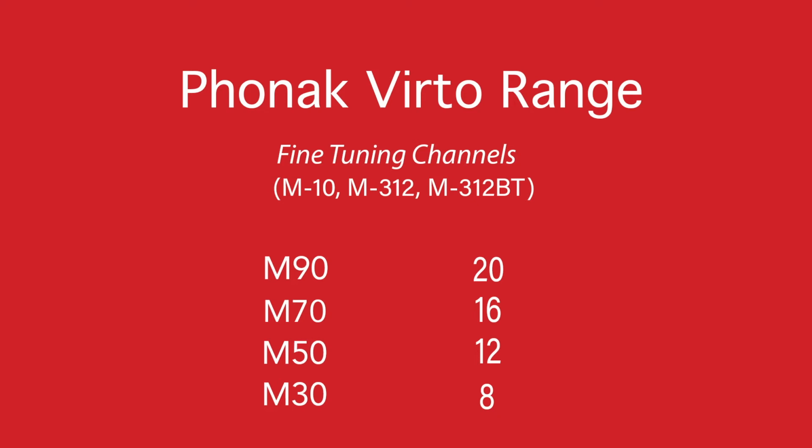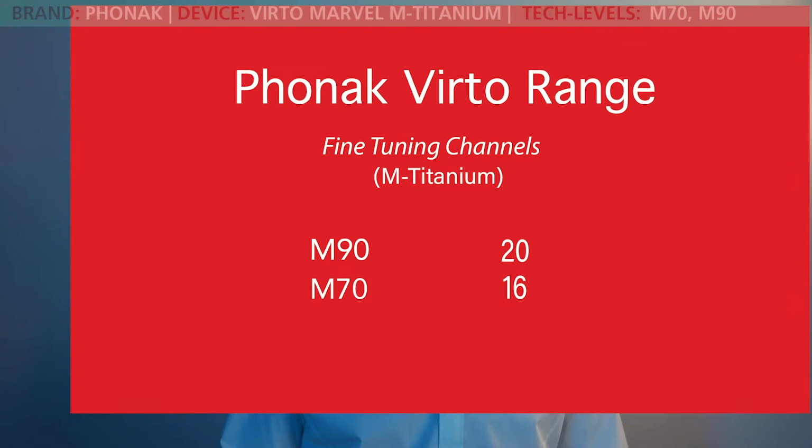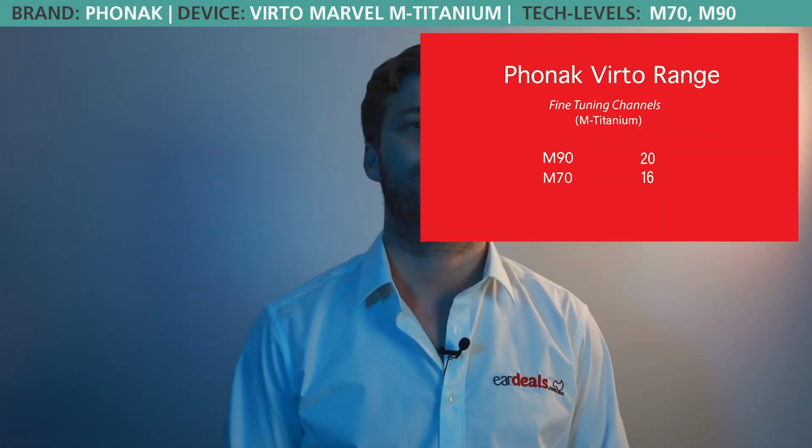The greater the sound clarity and the more features it has is basically attributed to the number of channels. Each of these channels work more aggressively. When they are working more aggressively, that is when the sound cleaning is happening in each and every channel.